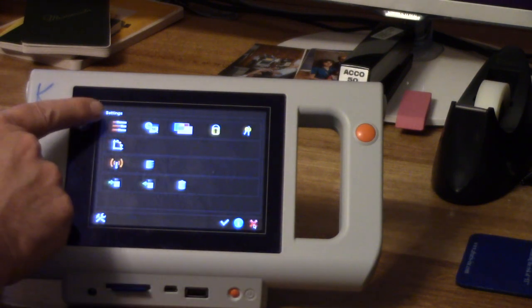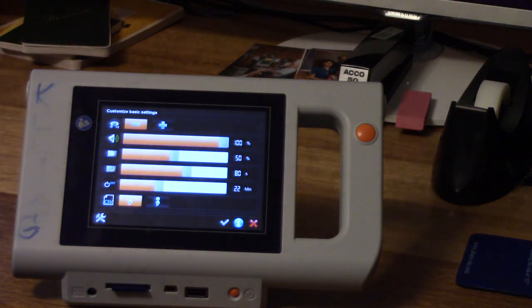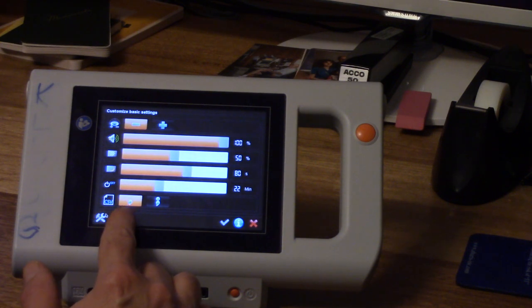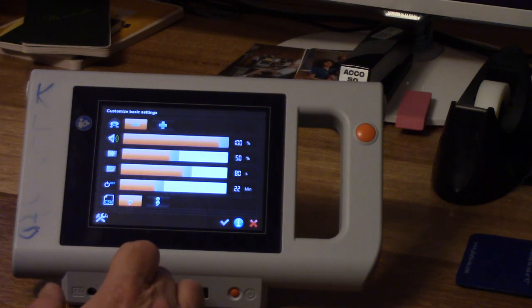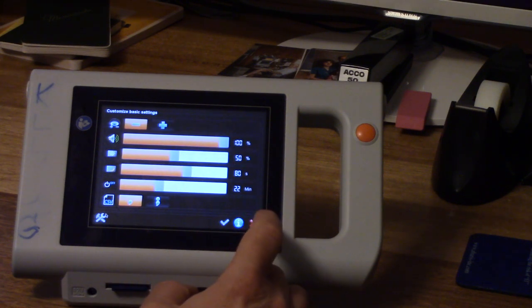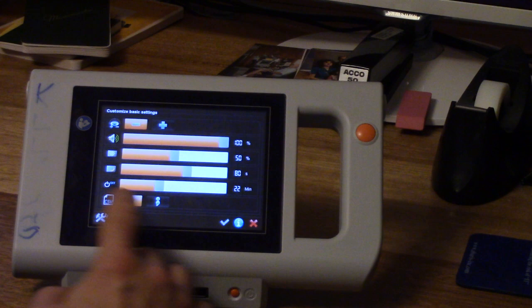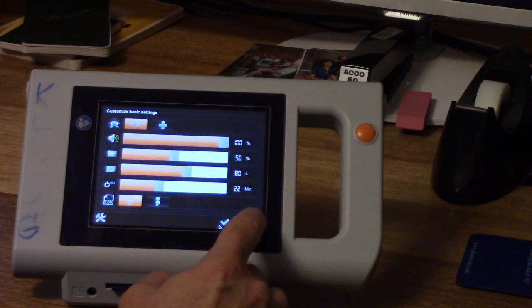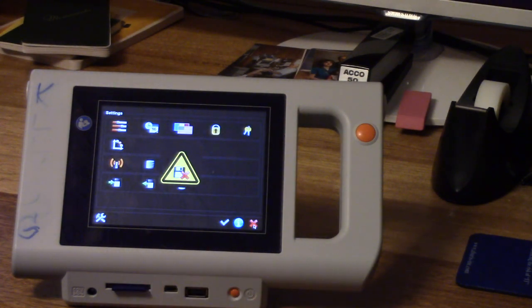And then we go to the first group of settings and we make sure that our CSV separator is a comma. When you get the machine, if you haven't changed it yet, it will be a semicolon. So you'll need to change that for this procedure to work. If you need to change it, you'll get a green check mark that you'll select to get back to the other screen and save the setting. Mine is already there. So we're there.